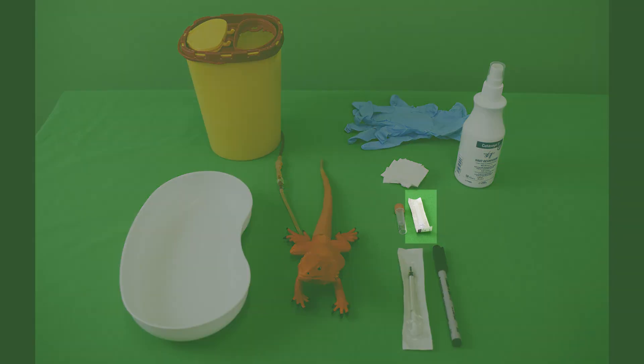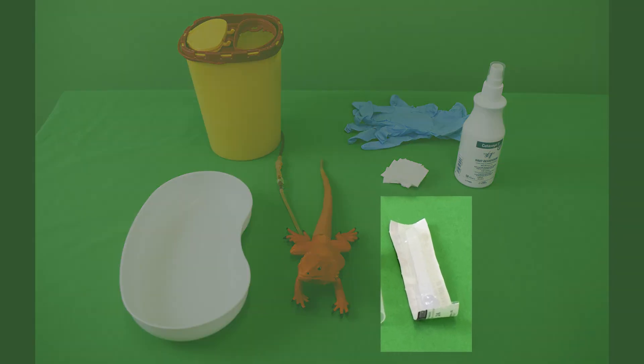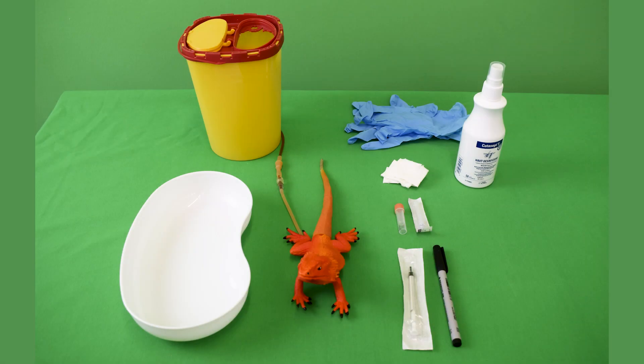Note: a cannula with a large volume should be chosen. With reptile blood, the relatively large nucleated erythrocytes, often low blood pressure, and quick coagulation can swiftly clog the cannula. Furthermore, blood samples are always taken without congesting the vein, leading to a blind puncture. This makes it possible to aspirate lymph as well as blood.